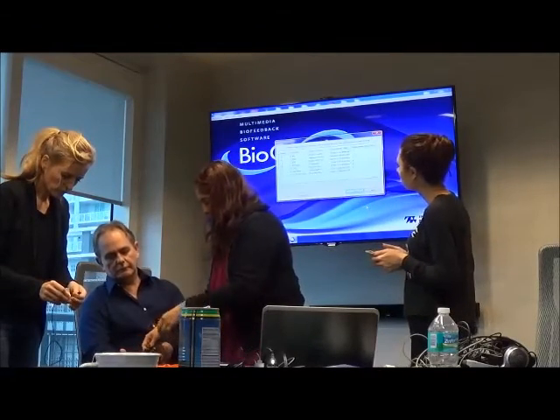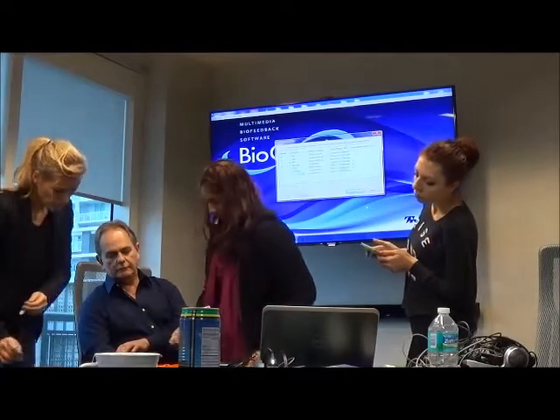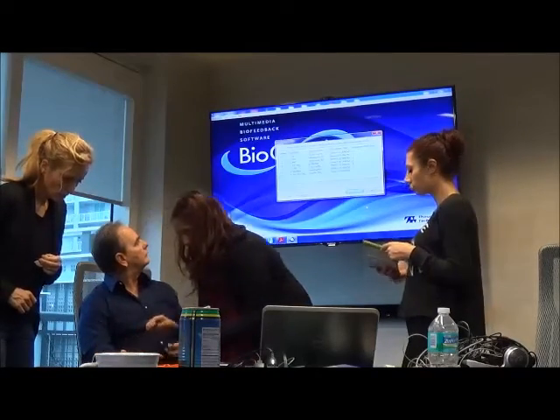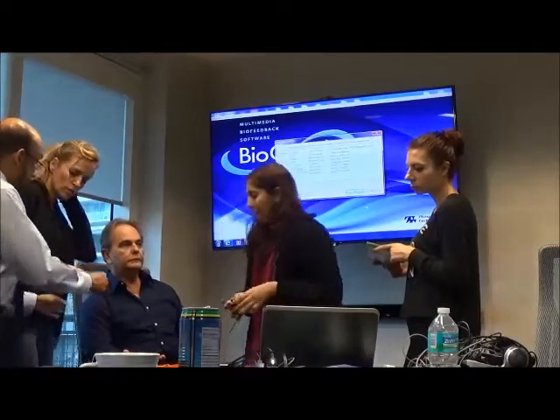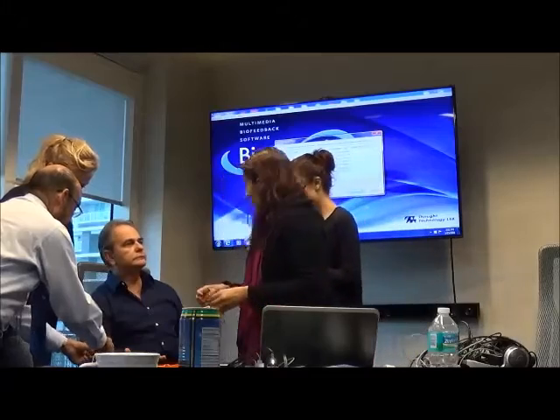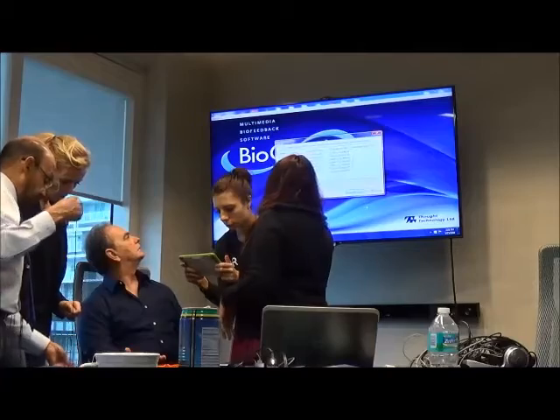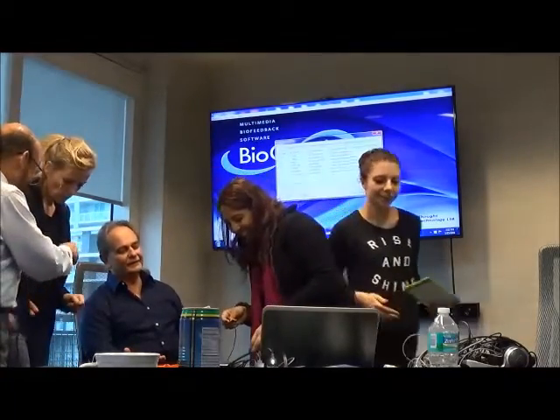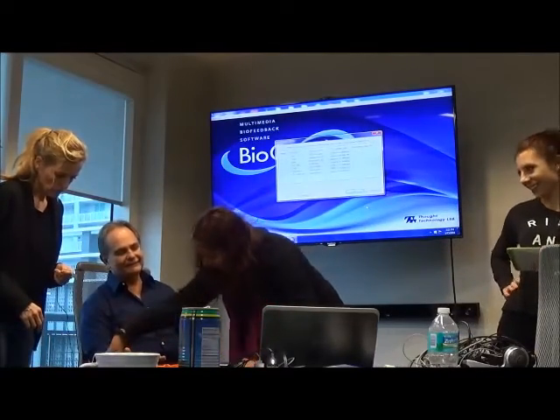So this is part of why you have to do so many practice sessions, so that when you're working with real patients, it's very comfortable and it's faster. And they don't say, "Do you know what you're doing?" Is this the first time you did this? Exactly. That you know what you're doing.